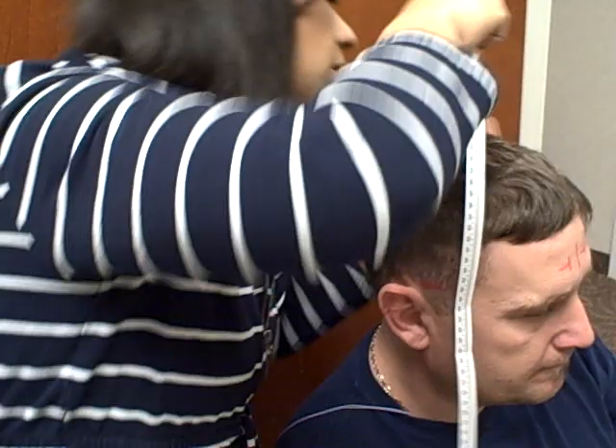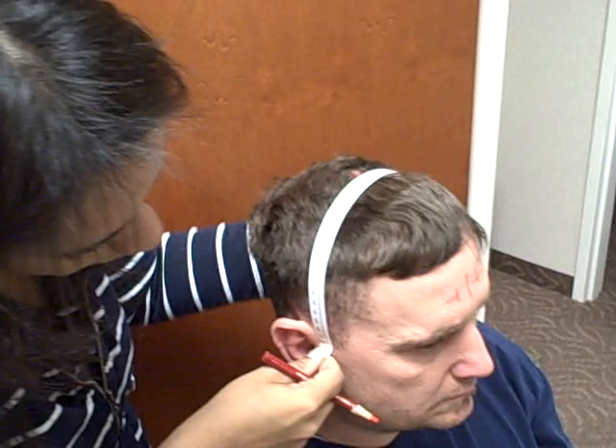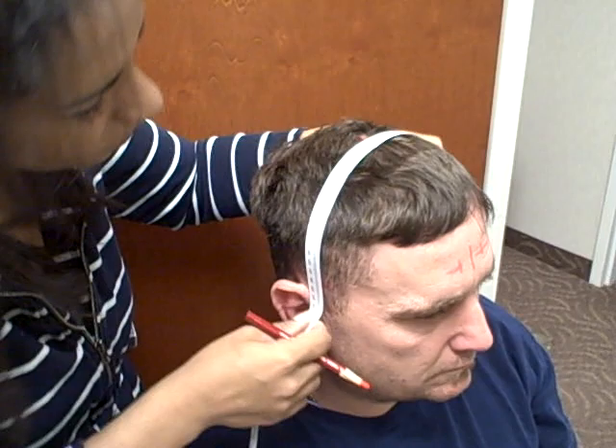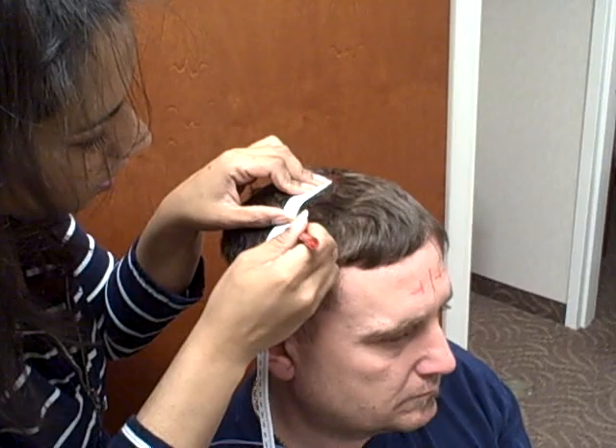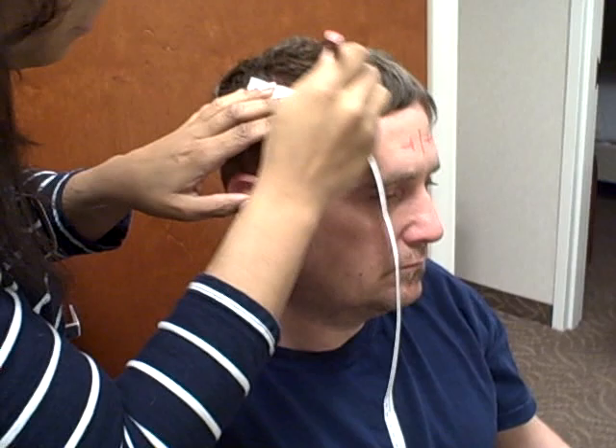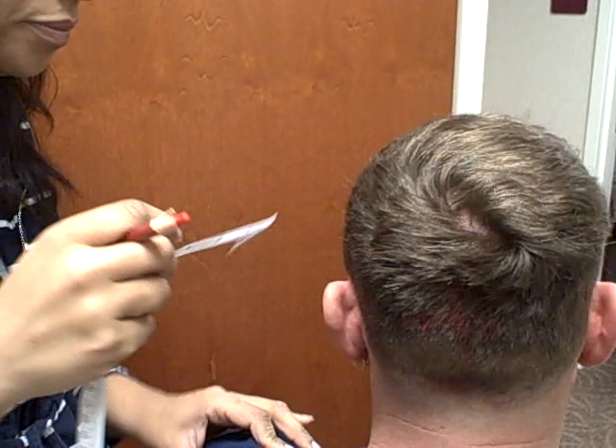In order to get C3 and C4, I'm going to do the same pre-auricular to pre-auricular measurement — I'm getting 38 centimeters. I'm going to come down 20% on each side and make a marker cross. It'll make a hatch mark right across that line. I'm also going to continue that line straight out to help with marking for the F electrodes, and do the same thing on the other side.